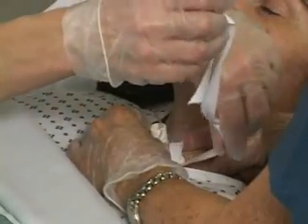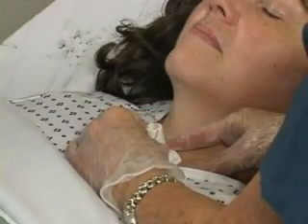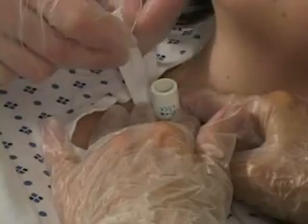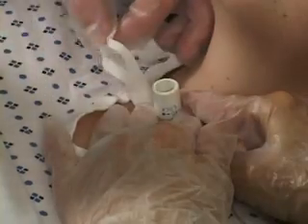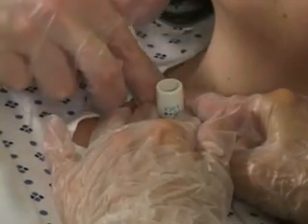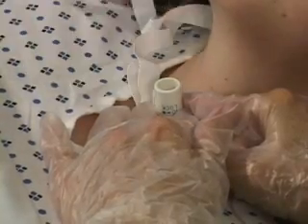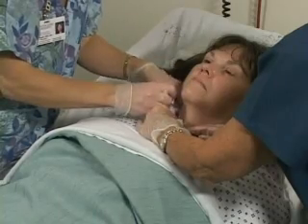Untie the old tracheostomy ties. If they are difficult, be careful if cutting them, as you do not want to cut through the cuff inflation tubing. Use tweezers to pull at them until they come loose from the neck plate. Insert the split end of the tracheostomy tape through the opening on one side of the tracheostomy tube neck plate. Pull the distal end of the tracheostomy tie through the cut end and pull tightly. Do this on the other side as well, while the second person continues to stabilize the neck plate.